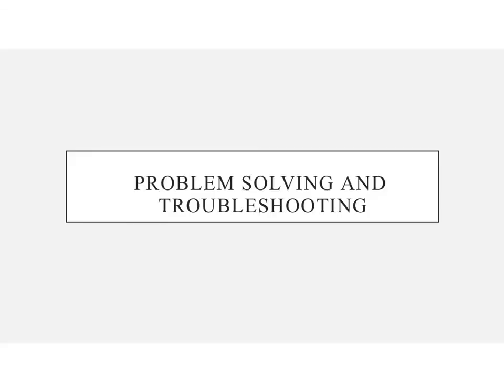We are going to go over some problem solving and troubleshooting that you may see with humidifiers. Problem solving and troubleshooting is something that you need to be able to do with any type of treatment. Like when we talked about bubble humidifiers and you hear the pop-off valve, what should you be looking for? It may be something as simple as a kinked oxygen tubing for a bubbler.